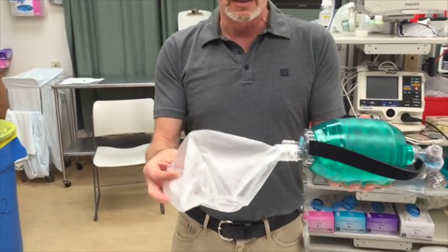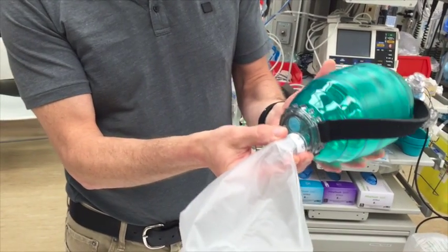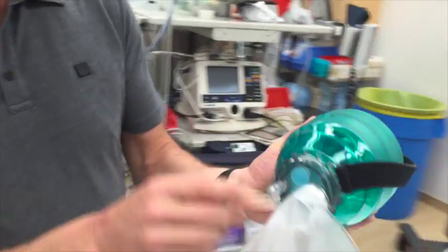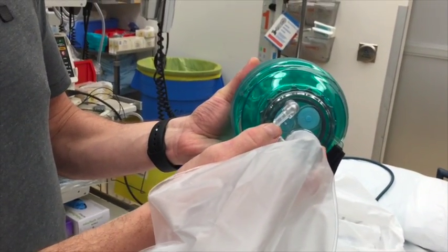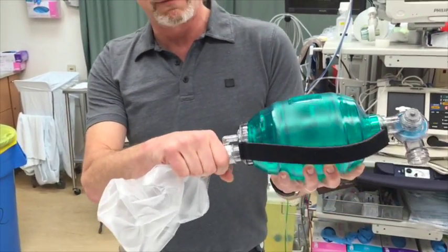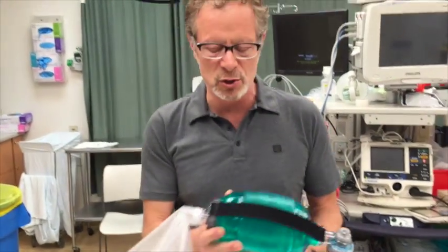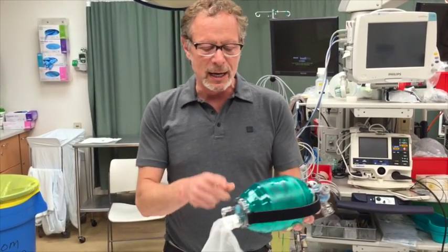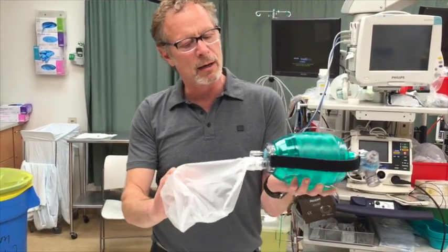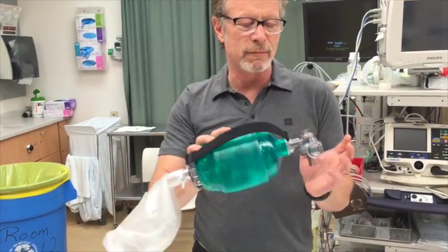On the back end they're the same in terms of components: they have a reservoir bag, two valves between the reservoir bag and the manual bag — one is an air intake valve to prevent suffocating the patient, and the other is a safety valve so you don't provide too much flow. There's also a one-way valve between the reservoir bag and the manual bag to move flow from reservoir to manual bag to the front end.